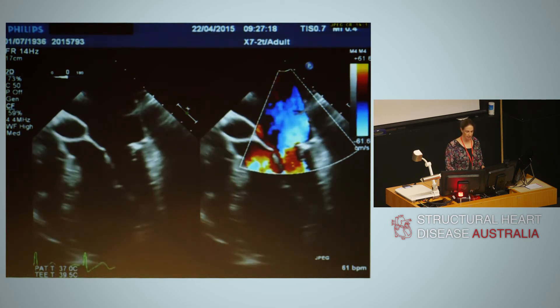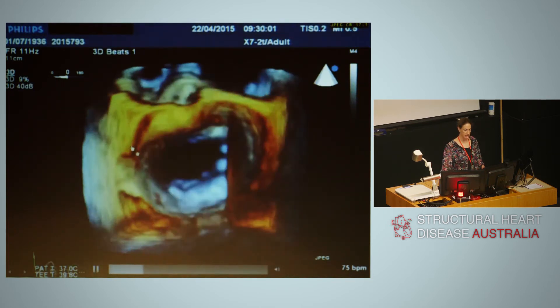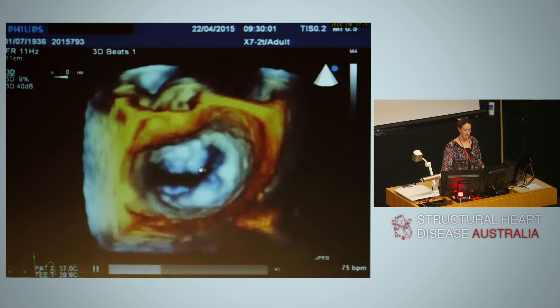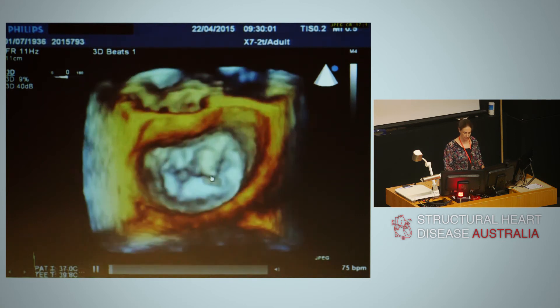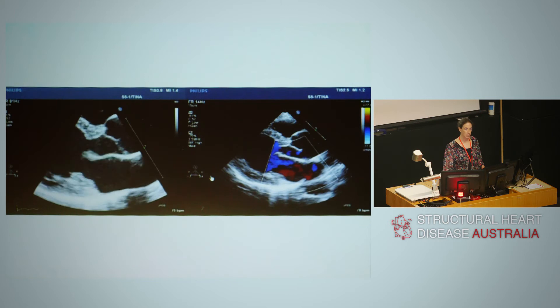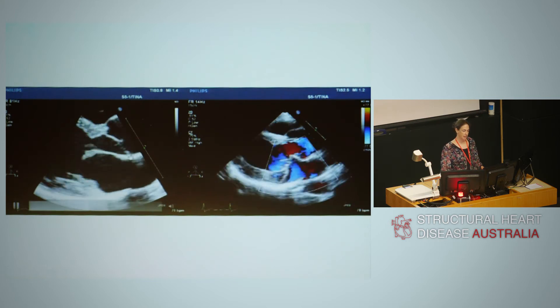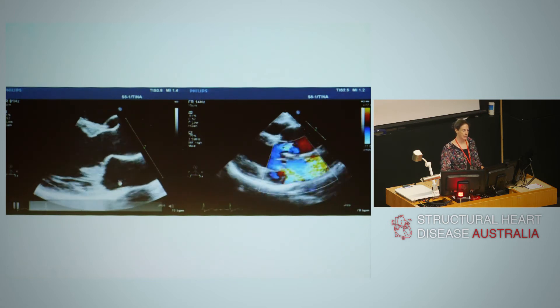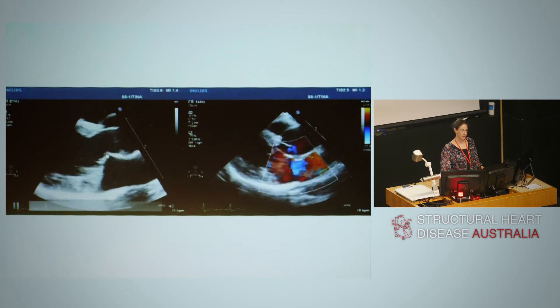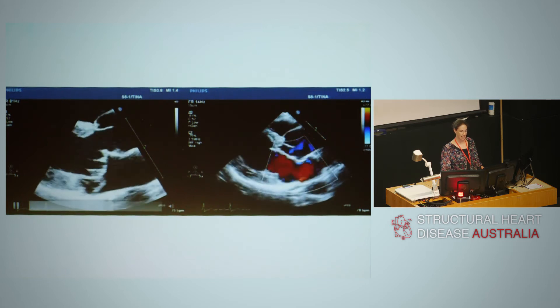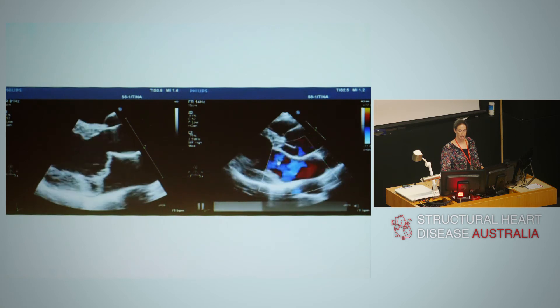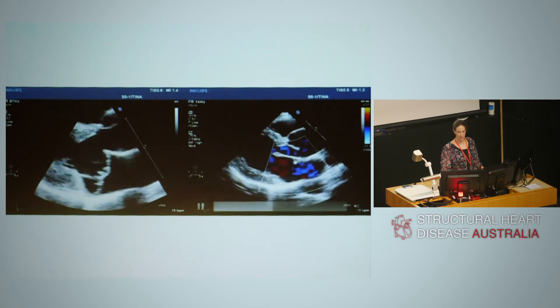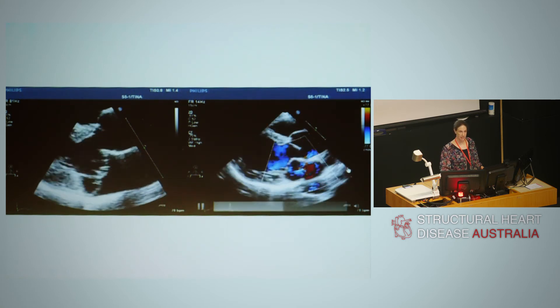On transesophageal imaging, this shows the A2 prolapse and the flail cord. Back to transthoracic — this valve looks thickened, myxomatous, and we can see bileaflet prolapse back into the left atrium, with a colour jet filling the left atrium of mitral regurgitation.